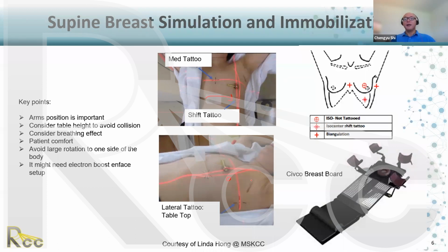At least we freeze the motion, ideally, but you're not really freezing it because there's still some motion. So if you cannot do it with DIBH, free breathing with ITV planning is still okay, adequate enough. Definitely you irradiate more healthy tissue, but that's all you can do.